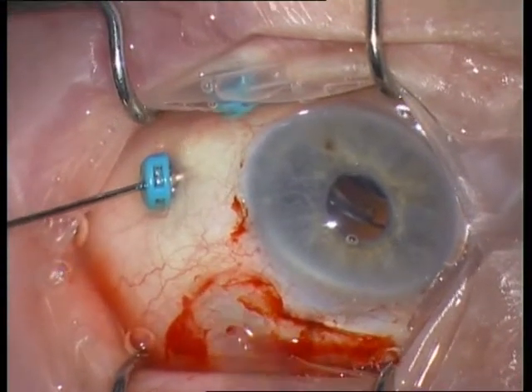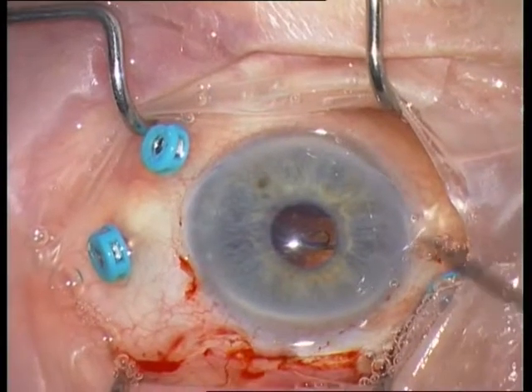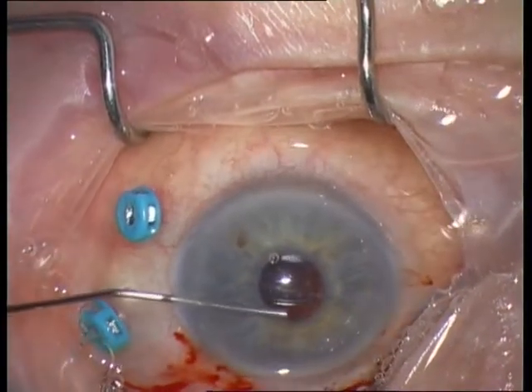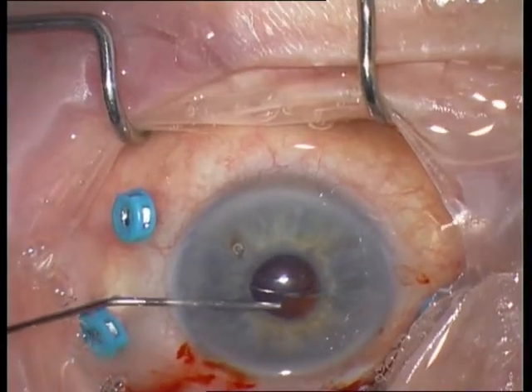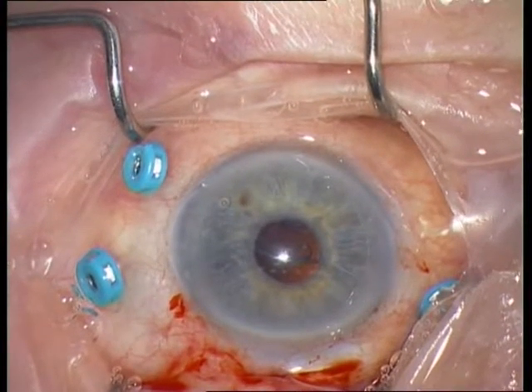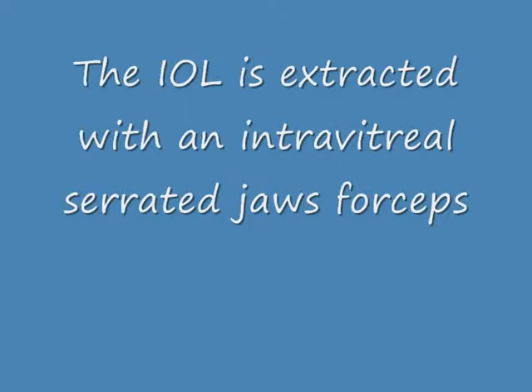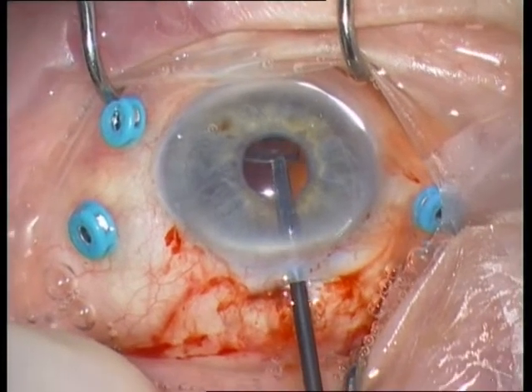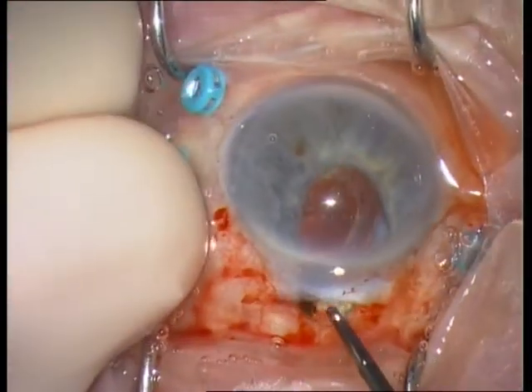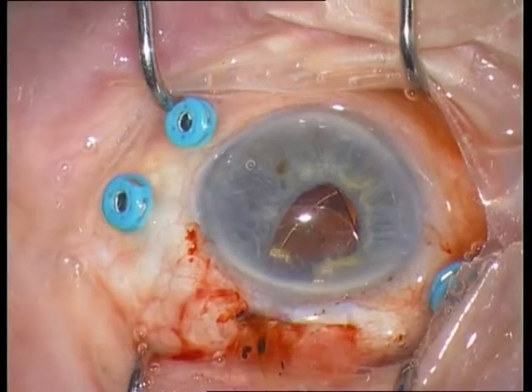If you look carefully, you can also see the capsular tension ring and the haptic. Inject a little more viscoelastic into the anterior chamber, grasp the haptic, and pull out the IOL. It is a bit more difficult due to the capsular tension ring.